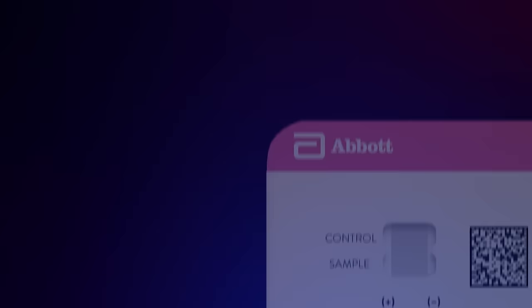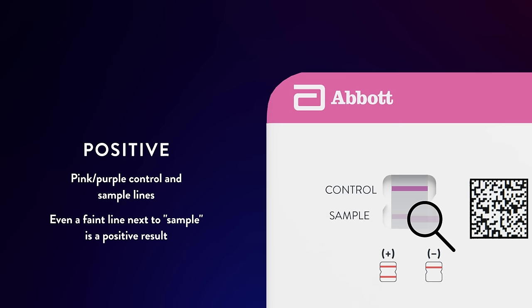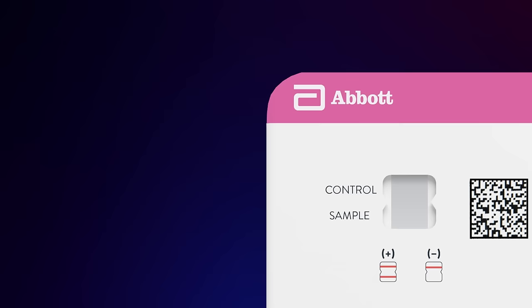To check for a positive result, look at the result window carefully for two pink or purple lines. Make sure you look closely at the bottom half of the results window, where it says sample. Even a faint line next to sample is a positive result.